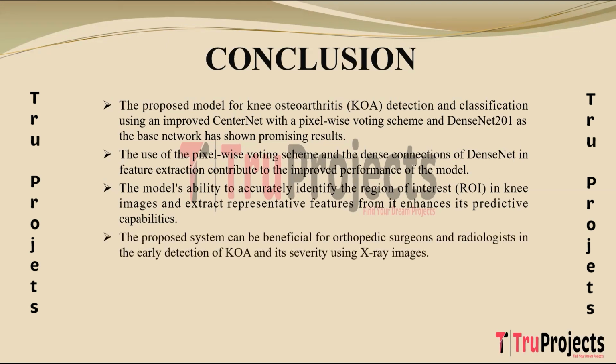The proposed system's proficiency in early detection of KOA and its ability to assess the severity using X-ray images holds significant promise for orthopedic surgeons and radiologists. It empowers these healthcare professionals with a reliable tool for early diagnosis, aiding in prompt intervention and treatment planning for patients suffering from KOA.